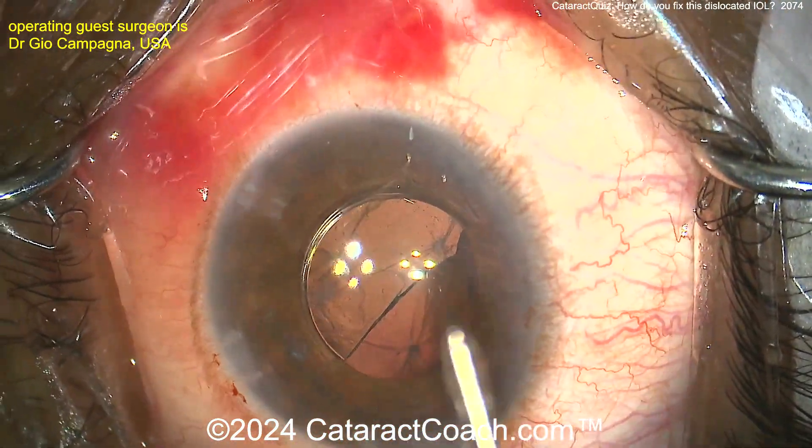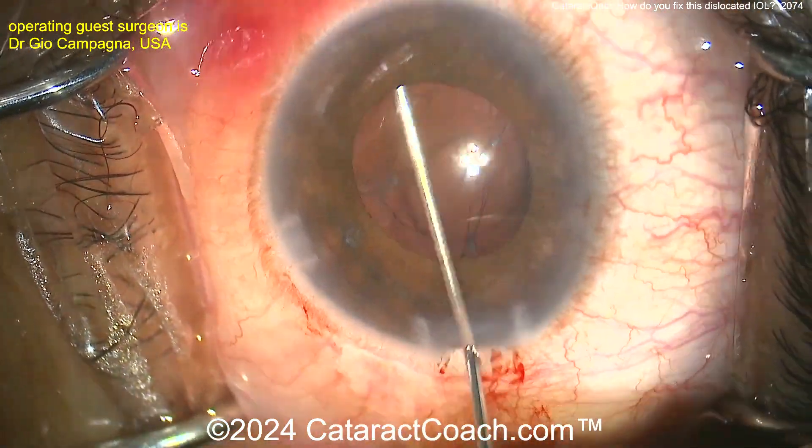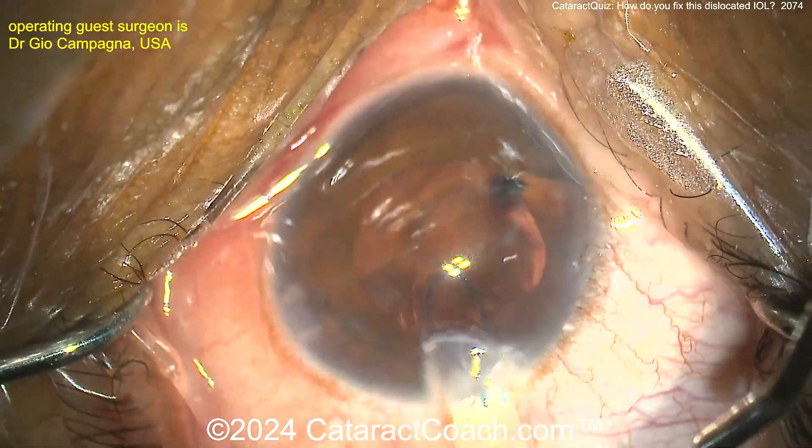I'm just giving you a hard time. Let's get the lens up — here it is, pull it out of the eye. We've obviously sped up the video here. More viscoelastic — looks like there's no vitreous that's prolapsed up.